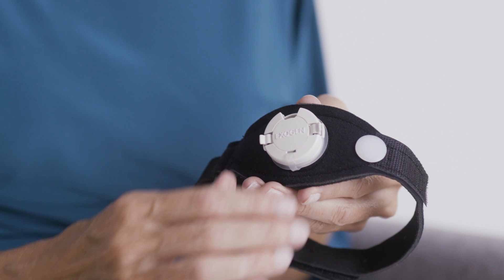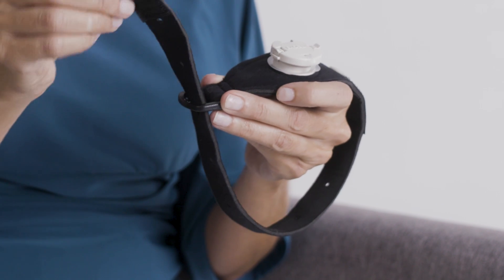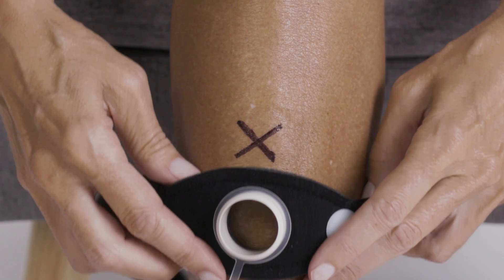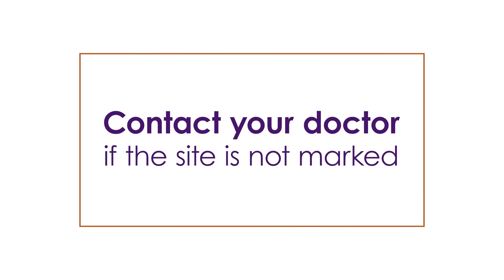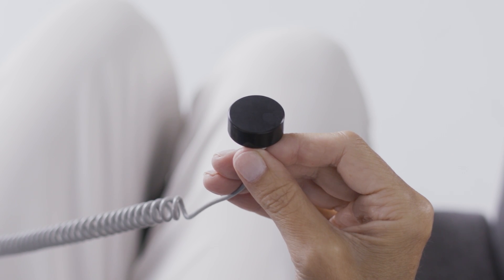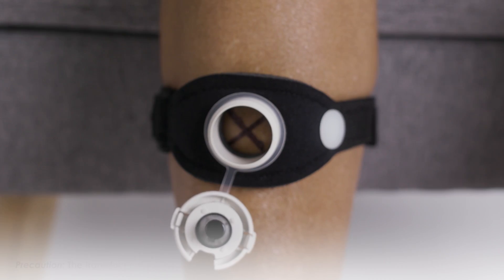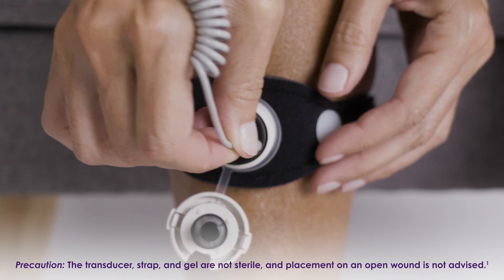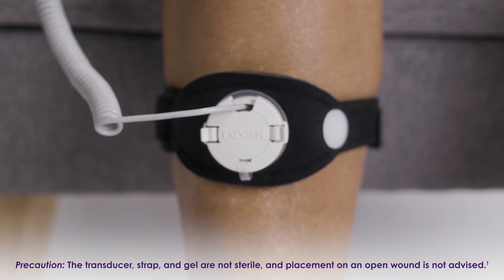To prepare for your treatment, open the cap by squeezing the cap tabs together with your fingers. Position the strap with the cap facing up and pull the long end of the strap through the plastic loop. Place the port over your fracture site, which your doctor marked with an X. If the site is not marked, contact your doctor to confirm the fracture location before you begin Exogen treatments. Tighten the strap so it is snug but not too tight and fasten it in place. To apply the gel, hold the transducer with the cord facing down and the smooth side up. Squeeze a pea-sized amount of gel onto the smooth side of the transducer. Place the transducer gel side down into the port so the gel is touching the skin over your treatment site. Place the transducer cord into the notch so the cord comes out of the cap and snap the cap shut.